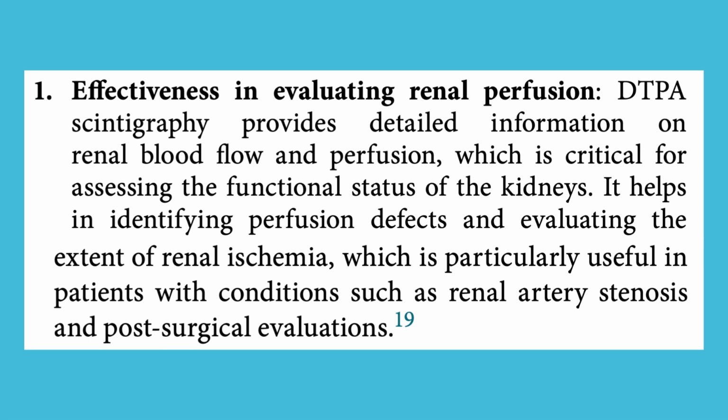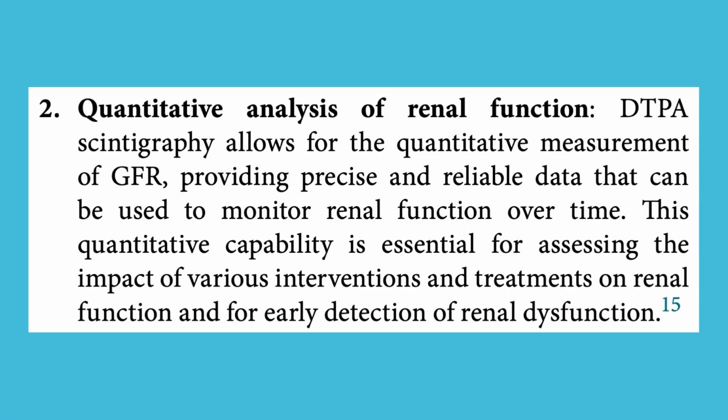1. Effectiveness in evaluating renal perfusion. DTPA scintigraphy provides detailed information on renal blood flow and perfusion, which is critical for assessing the functional status of the kidneys. It helps in identifying perfusion defects and evaluating the extent of renal ischemia, which is particularly useful in patients with conditions such as renal artery stenosis and post-surgical evaluations.